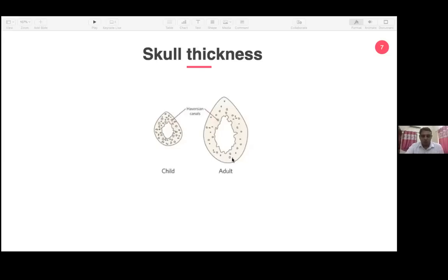So that is the reason why, in case if you have to drill a scalp bone or the skull or the mastoid system, if you see a lot of marrow bone that was described by Dr. Manu in his earlier presentation of the imaging, where he said that one has to see whether it is well pneumatized or a diploic bone or a marrow bone there. If one has seen a lot of marrow bone on the imaging, one has to go for a drilling starting with a diamond burr instead of going with a cutting burr.